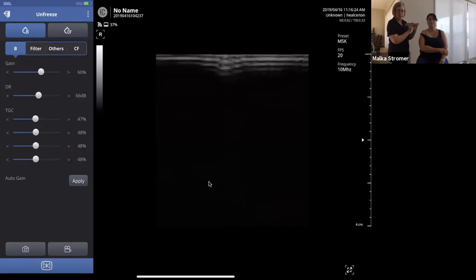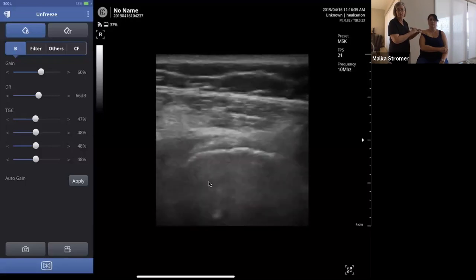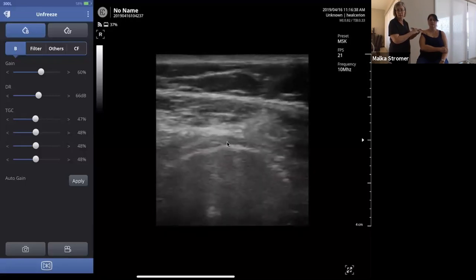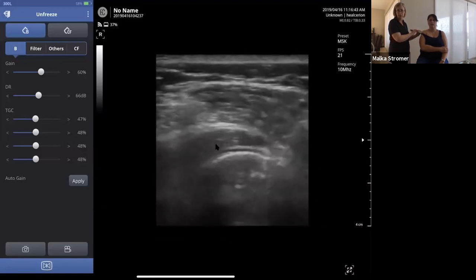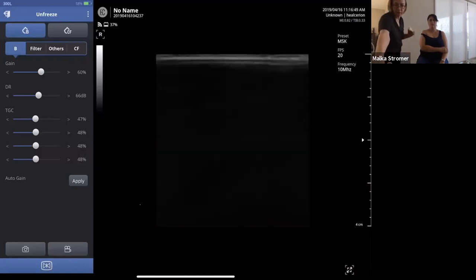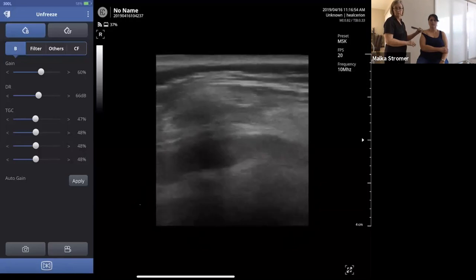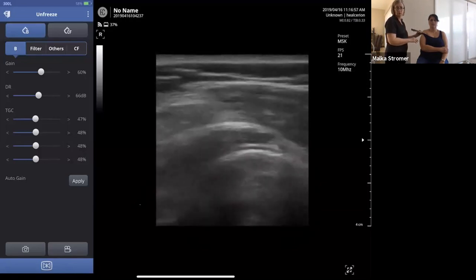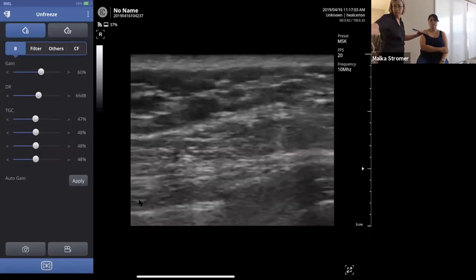Infraspinatus, I like to start with the notch toward the back, the transducer parallel to the ground and horizontal. And start low. There is your infraspinatus, the insertion. I'm going to come posterior, following the bone, kind of hugging the body with the probe. I'm going to add just a little more gel here. So humerus, following it posterior. I'm going to change the depth. Whoop, the other way.